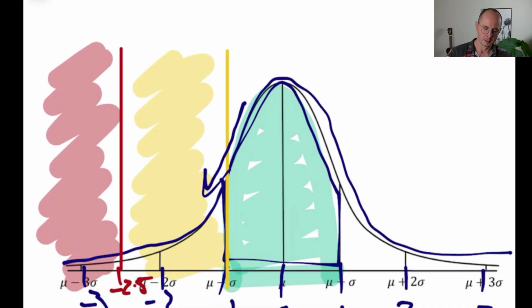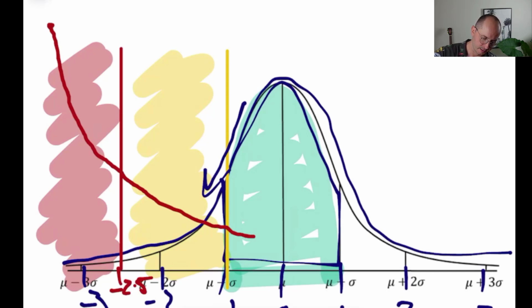But what's important to understand is how this affects your risk of breaking a bone, because the scores alone don't do it justice. So if we were to draw a line that represents your relative risk of a fracture, it would look like this. It starts off very high up here, and then starts to fall very quickly, and then starts to peter off, and then slowly approach the bottom line here.